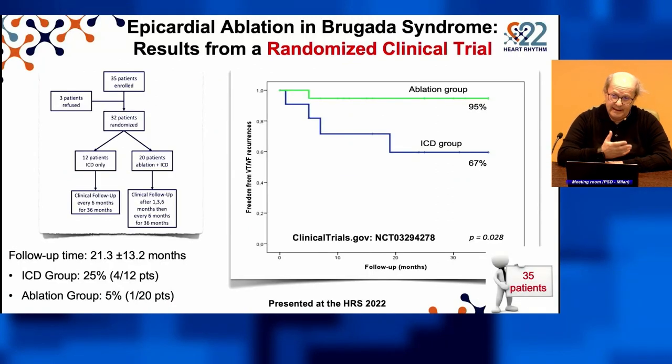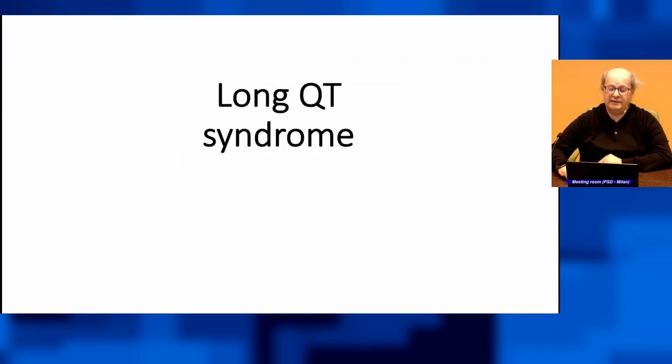This was a registry, but this is a randomized study, and we are going to stop this study because the difference between the ablation group and the ICD group is so large that it's not ethical to continue. But actually, it's very clear that Brugada is localized in the epicardium. No doubt that we can ablate Brugada with this superficial lesion.